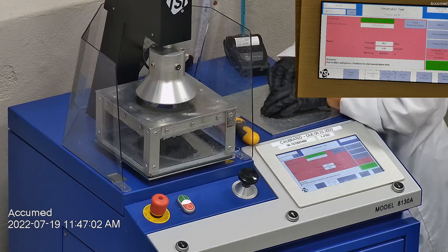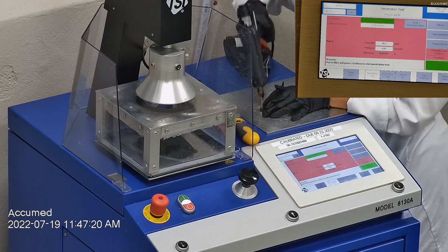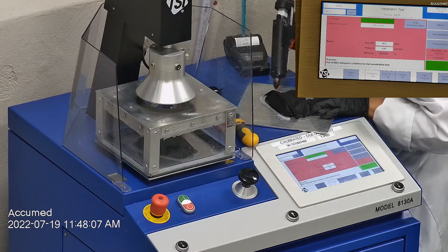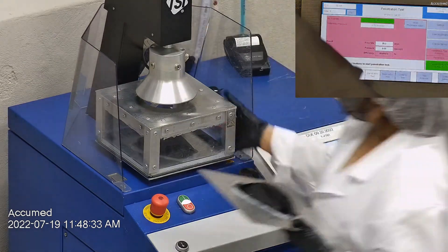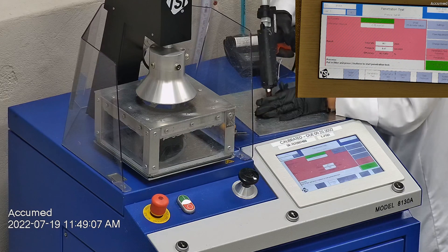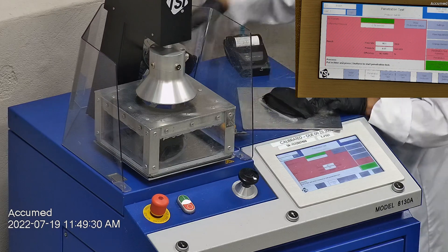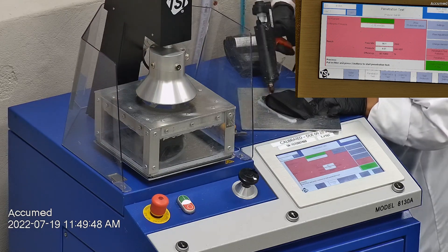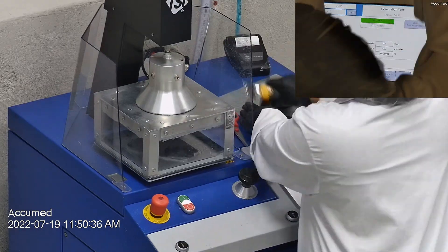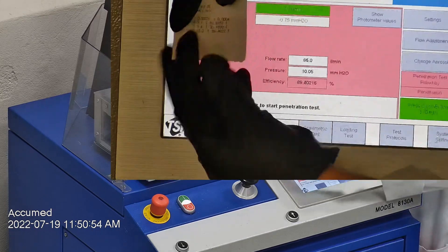The first sample tested at 89.98% filtration efficiency with a pressure drop of 9.1 millimeters of water. The second sample had a filtration percentage of 90.10 and a pressure drop of 9.4 millimeters of water. The last sample's filtration percentage was 89.40 and had a pressure drop of 10 millimeters of water.